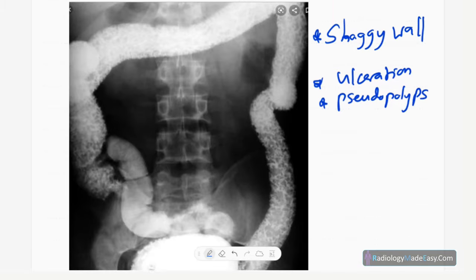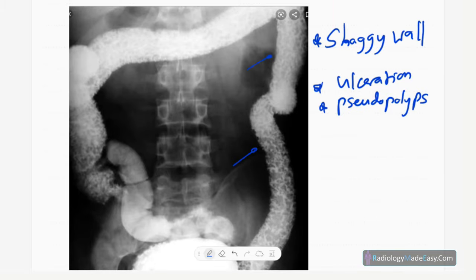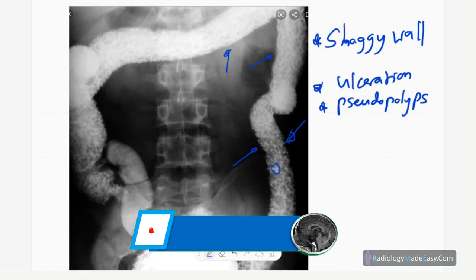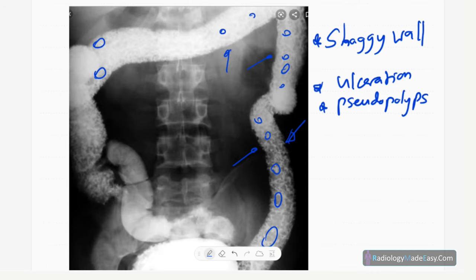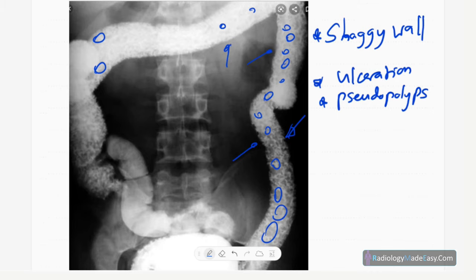In another barium study, you can see an irregular outline of the bowel loop due to ulceration, along with multiple filling defects due to pseudopolyp formation in the normal mucosa. Multiple polyps and ulcerations are seen — this is an example of ulcerative colitis with filling defects and a shaggy outline.